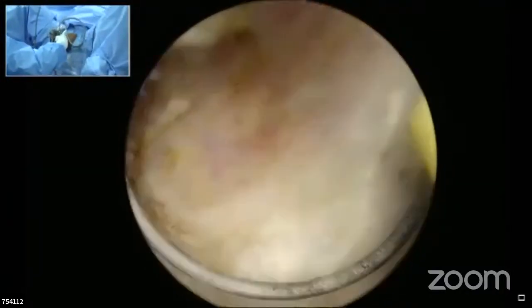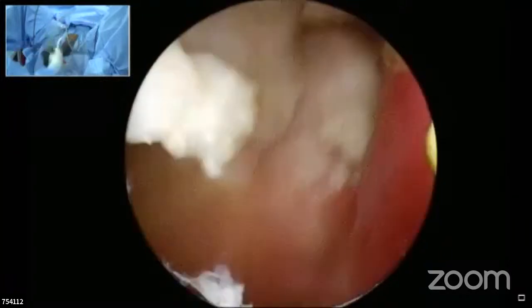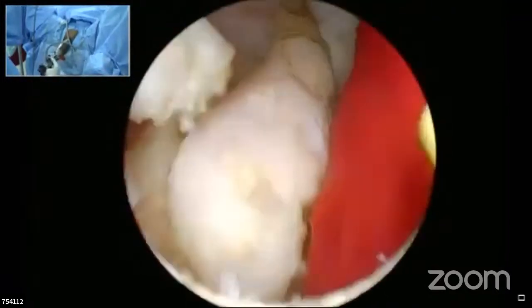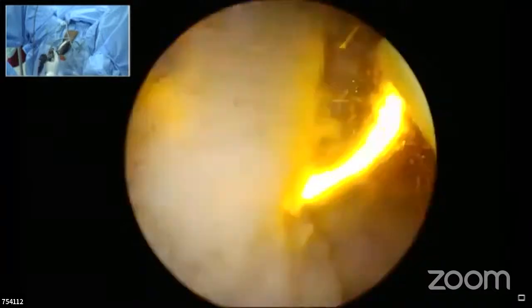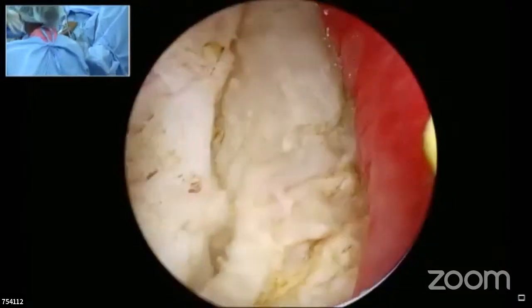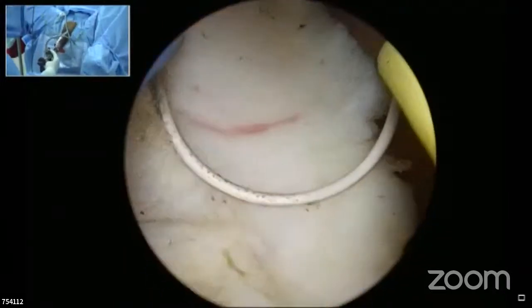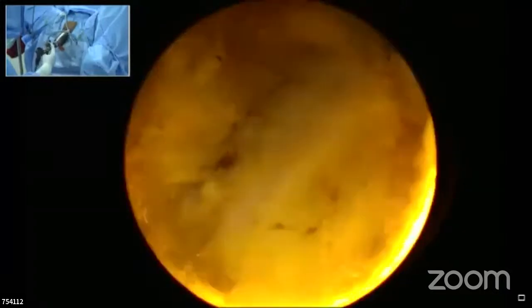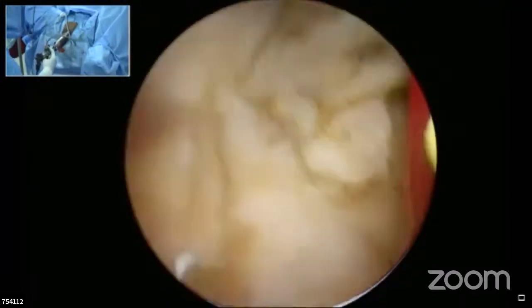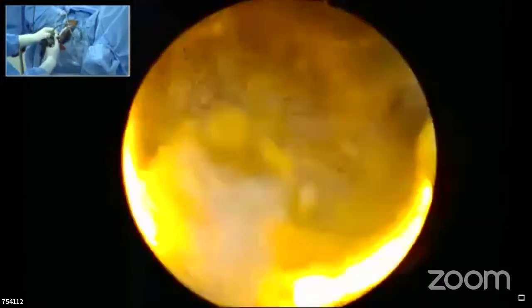To seal it, if it is a smaller perforation, you can take the 2 edges together with a low coagulating current and hope to seal it. But believe me, nothing of that works. Eventually, you will have to use traction, you will have to use pressure to stop a sinus bleed. If you unfortunately do have a sinus bleed like this, you might have to stop the procedure and come back another day to do the rest. Of late, after the camera and all, I think the incidence of sinus injury has come down. We are able to see it quite magnified, and we are more experienced, possibly.